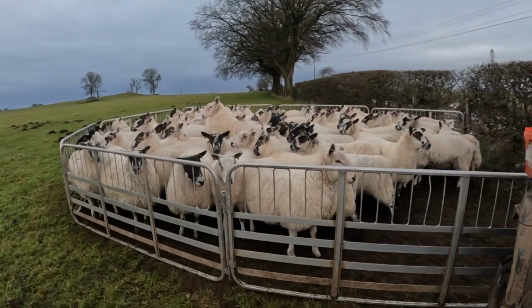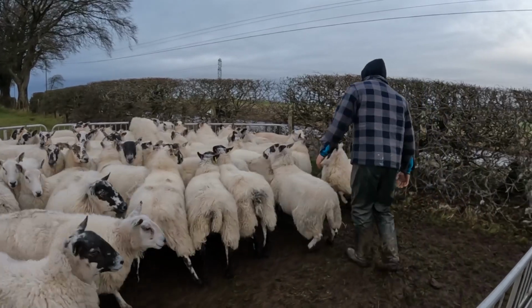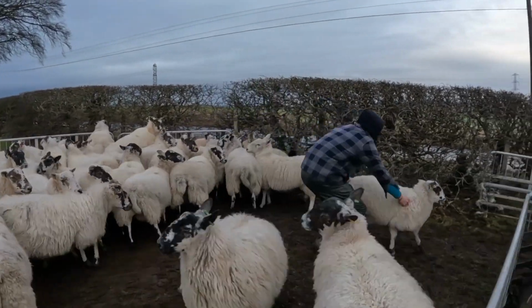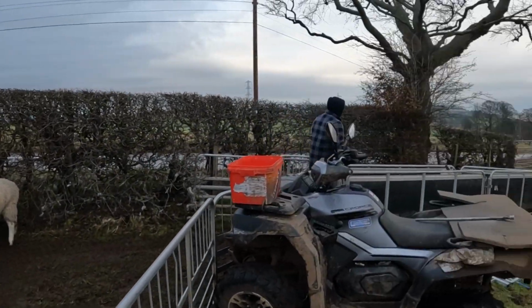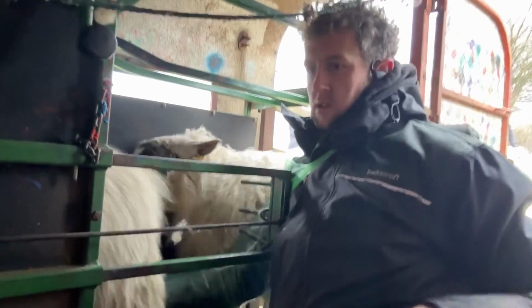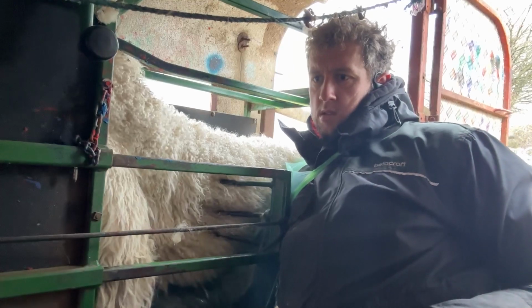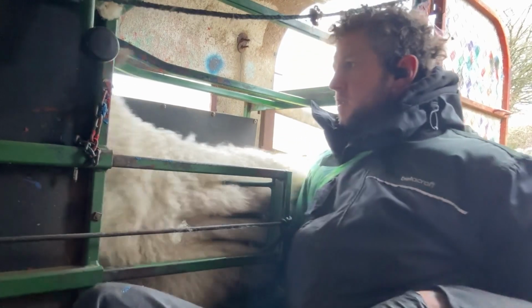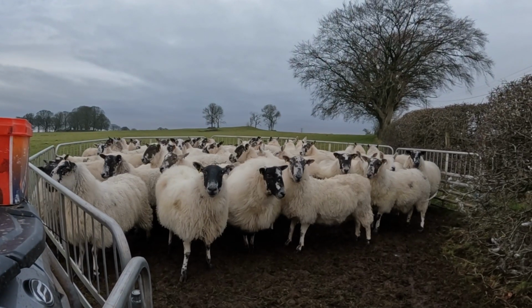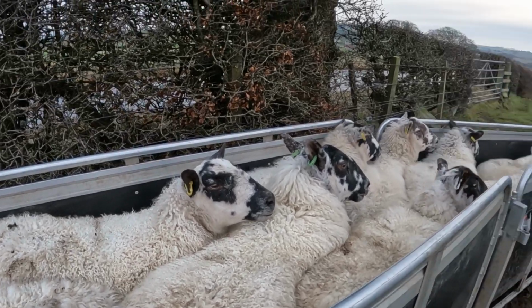I've jumped into the scanning trailer, so Marissa has taken over the camera work. There are 66 sheep in this batch, and that's Jock you see there, doing the hard work, pushing them up towards me. I'm now in the trailer ready to scan. This batch of sheep are mostly gimmers, which is a 2-year-old sheep, and it'll be the first time that they have been pregnant. Now, looking at the condition of them, I would expect a good conception rate, so most of them should be in lamb. However, with them being younger sheep, I wouldn't expect a big scan.